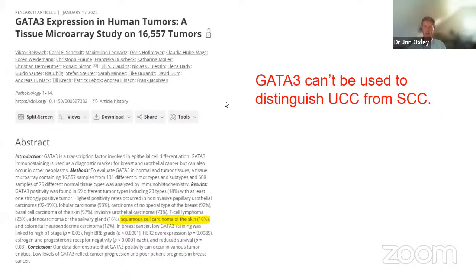I'm not quite sure, Nick, you're more of an expert in this area. Is uroplakin good at doing this distinguishing? Well, certainly uroplakin 2 now is more sensitive. That's been the problem with the uroplakins, that the sensitivity was quite low, but the uroplakin 2, which we do use, is quite useful. It's not positive in all the urothelial tumors, but it is positive in a significant number, and it doesn't stain squamous epithelium with strong cytoplasmic staining, and we found it quite useful in the metastatic setting, actually, for non-small cell carcinoma. Okay, brilliant, thank you.